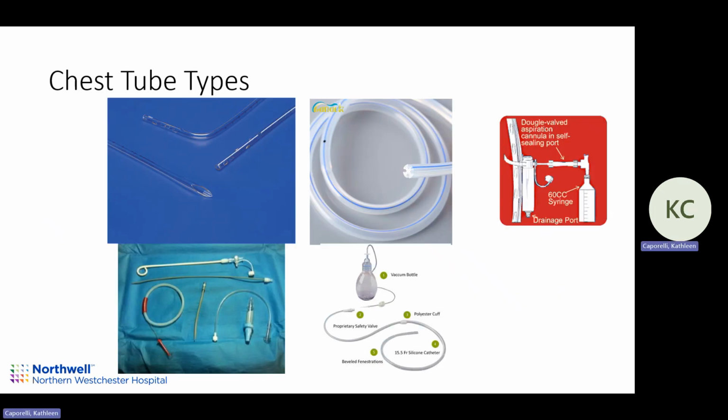All right. So there's a lot of different types of tubes. You can have straight, hard tubes. I think these are the majority of tubes that we have here. These are a bunch of different brand names, some of these Argyle, which is classically what we call them. And you can see there's a little white stripe there. That little white stripe is radio opaque, so you can actually see it on the X-ray, and that's how we know where this tube is.